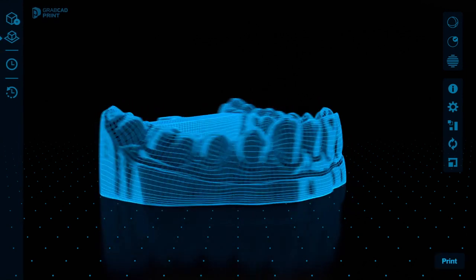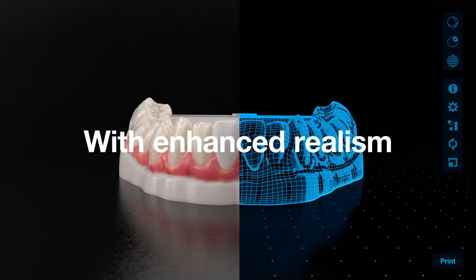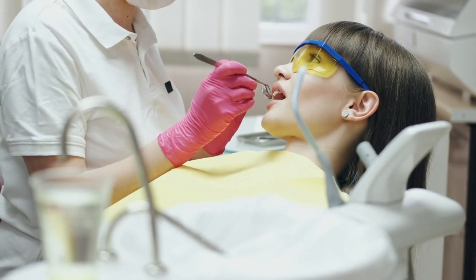Deliver patient-specific, full-color case presentations with realism previously only possible with time-consuming wax models. And better your communication with clinics.